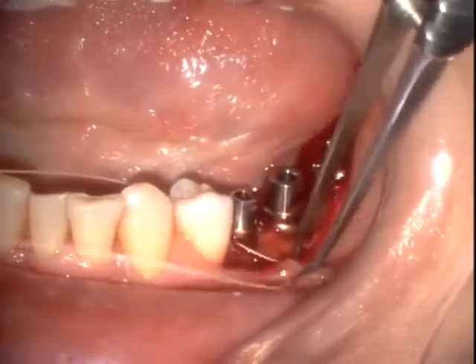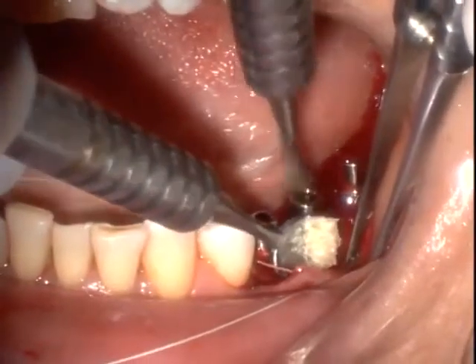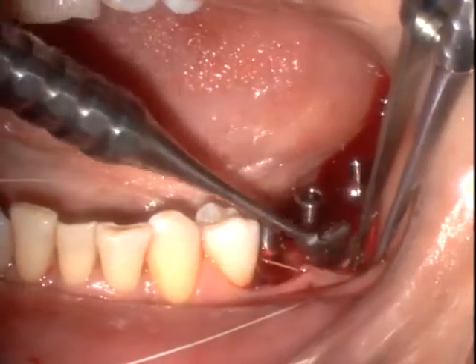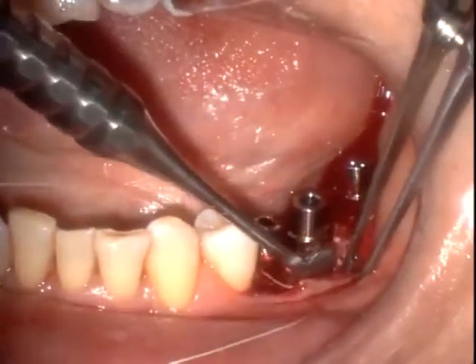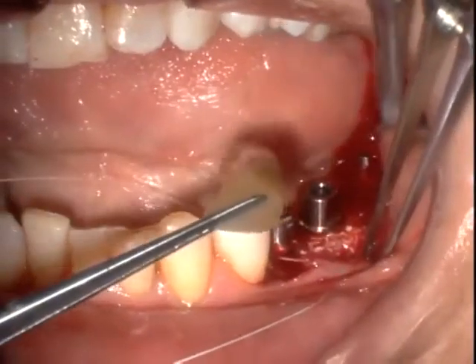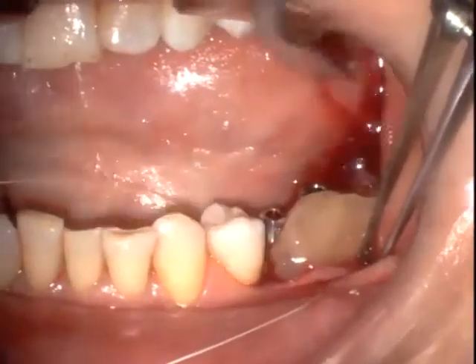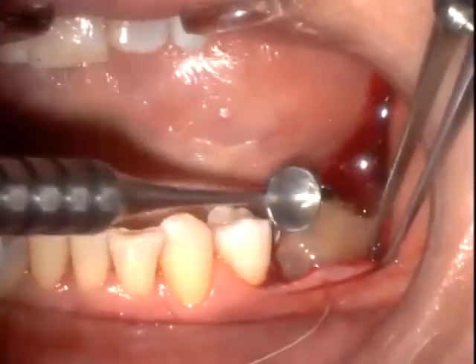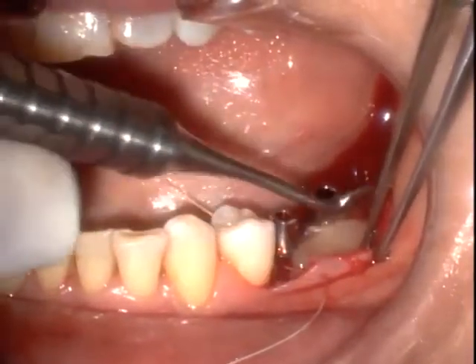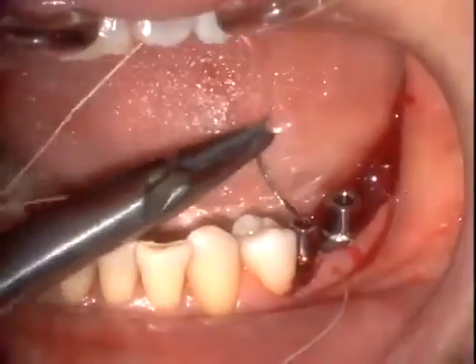A suture is going to be initiated on the mesial aspect of the first molar, and then bone graft material, this is mineralized irradiated allograft bone, is going to be utilized. These are cortical and cancellous chips to augment the small dehiscence on the first and second molar implants that have been placed. PRGF and fibrin are utilized as an autologous membrane to stabilize and protect the bone graft, as well as to act as a barrier membrane.